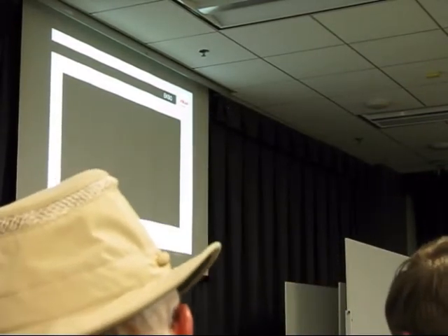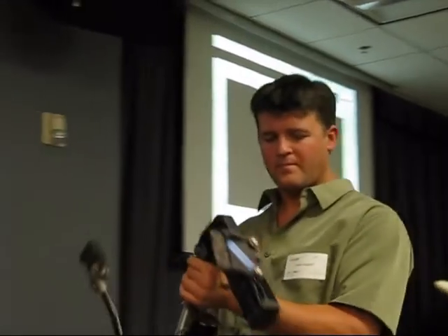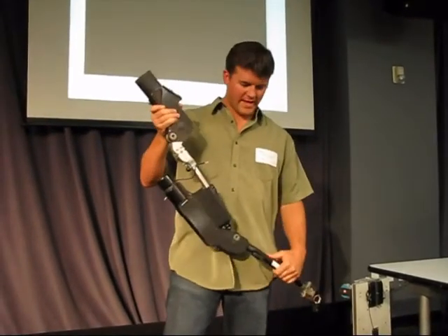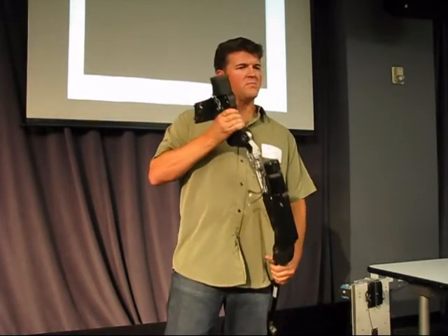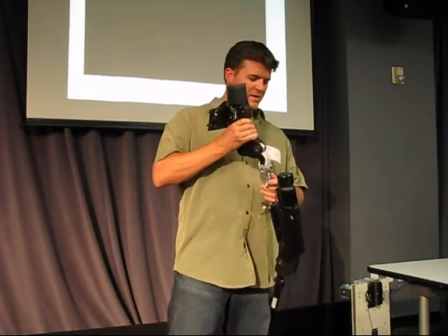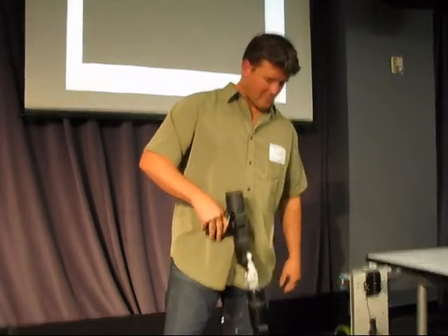This is a left exo leg that you guys can pass around or come take a look at. We power the hips and the knees. It's electrically actuated. We have a ball screw drive down to the legs that actually powers them, so you can hear the noise of the ball screw. Sprung ankles. We have locked out almost all other degrees of freedom on these exos, so most of the movement is in the sagittal plane. We do have mechanisms to unlock certain joints, and this is important for getting in and out of the exoskeleton. But when you're in walking mode, you actually want it pretty locked and rigid.